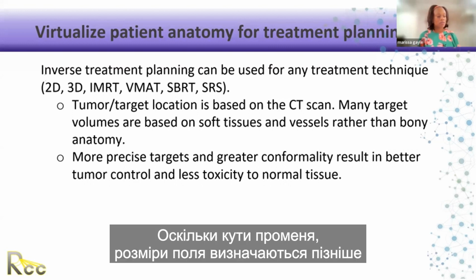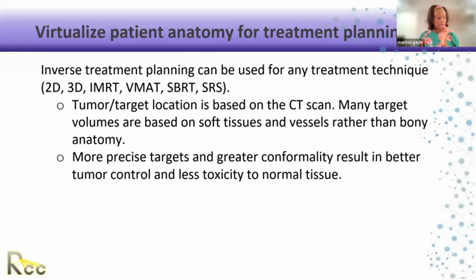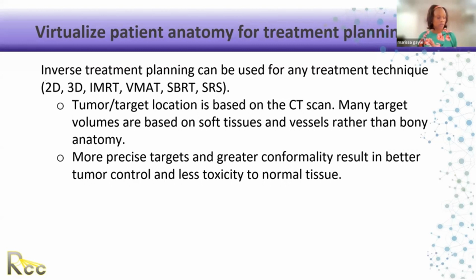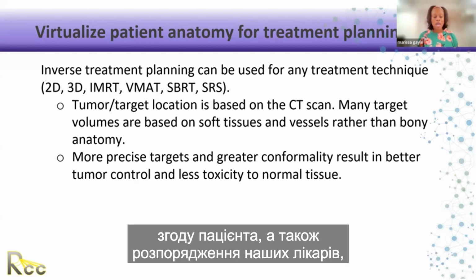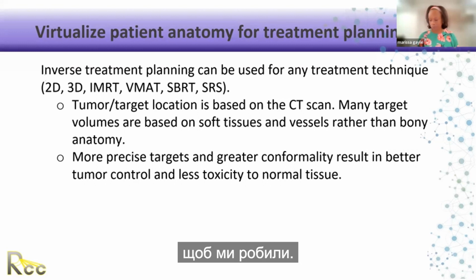Since beam angles and field size are determined later thanks to inverse treatment planning, the CT simulation process can be shorter. However, it's very important to do a high quality CT scan. And before we start the CT simulation process, we need to have, like I said before, a pathology report, a signed consent from the patient, and also our physicians have submitted orders telling us exactly what they would like us to do.